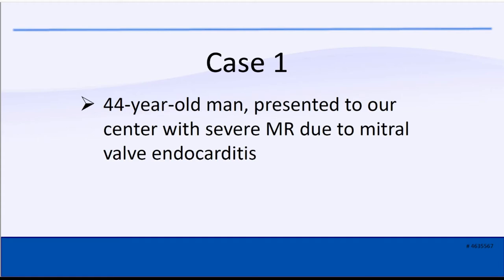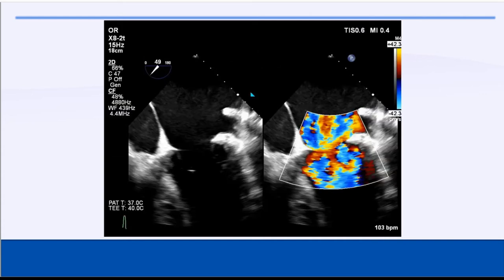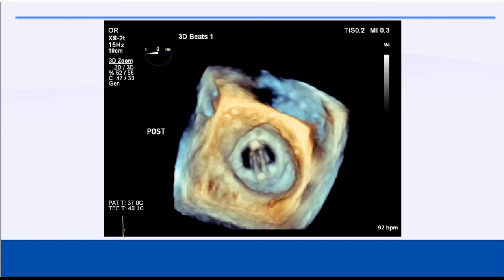It's a 44-year-old man presented to our center with severe mitral regurgitation due to mitral valve endocarditis. This case was done three or four days ago by Yakubo. The mitral valve is distorted by endocarditis, and you can see calcium in the mitral annulus. This is severe MR.